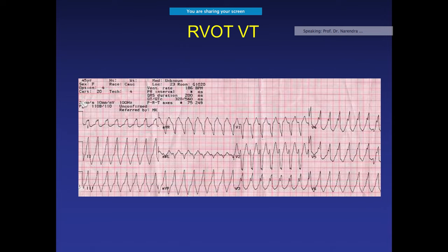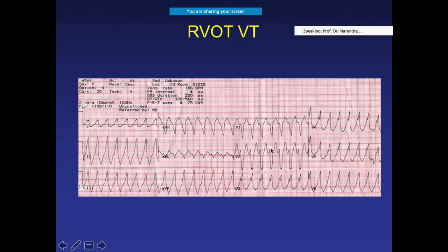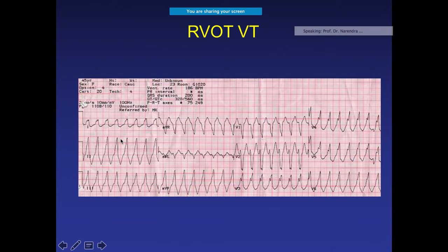To diagnose RVOT VT: first confirm AV dissociation indicating VT. Then look at the V1–V6 morphology — it will show a left bundle branch block pattern, meaning the origin is in the right ventricle. Then check the inferior leads (II, III, aVF) — if they are positive, the origin is pointing to the outflow tract, confirming RVOT VT. If lead I is positive, the exit site is directed toward the posterior medial wall; if negative, toward the anterolateral wall.